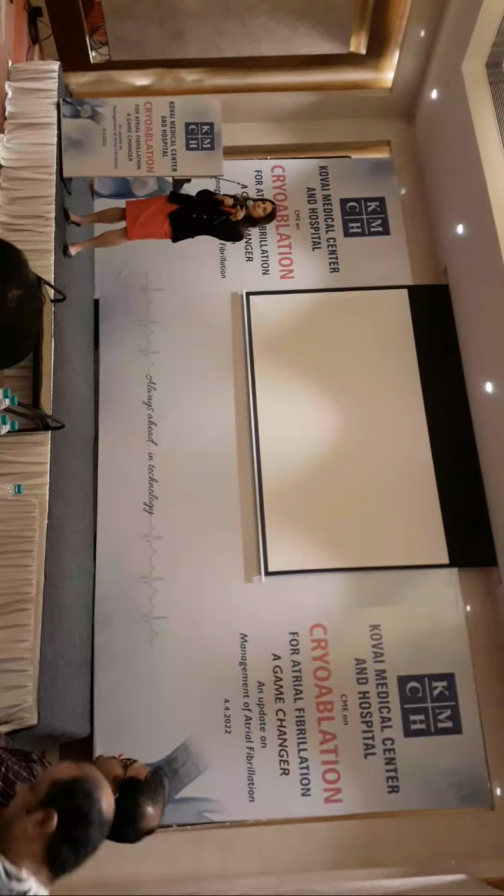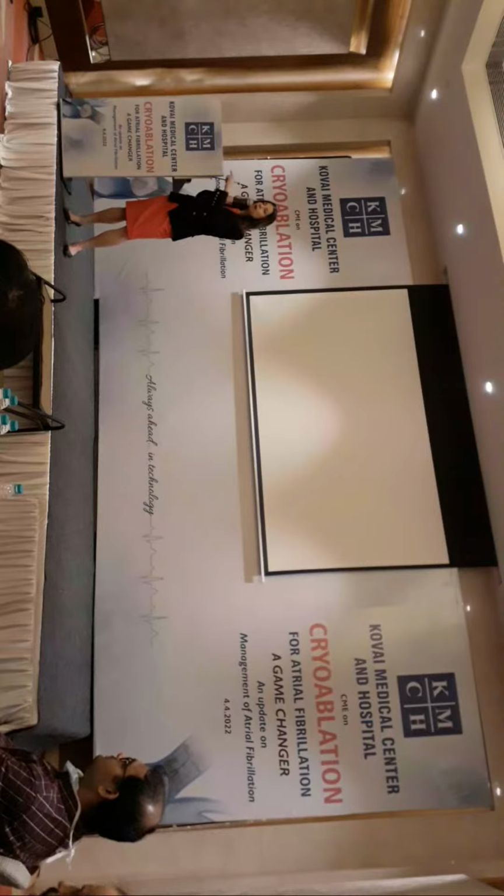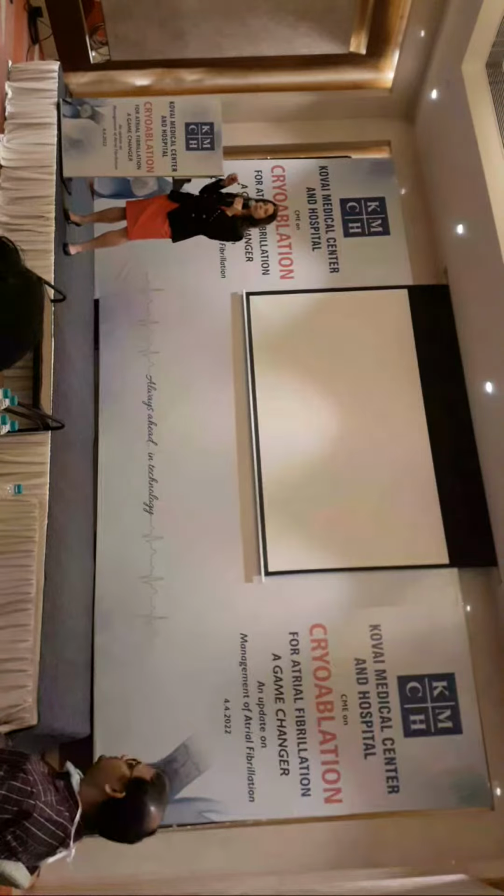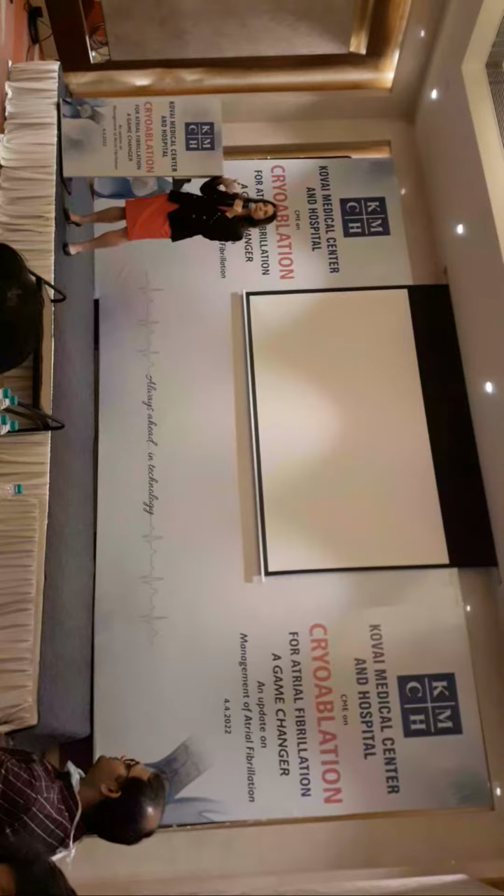With CMAP, we'll see the change first and call off, or just see loss of capture. Even when you're on your best game and you call off quickly, sometimes I have found a patient could have maybe 30 seconds of loss of phrenic capture. But usually if we catch it on a CMAP, we come off quickly, we can usually recapture that phrenic nerve within that case so that we can complete the ablation. So I think we've gotten excellent at doing that.